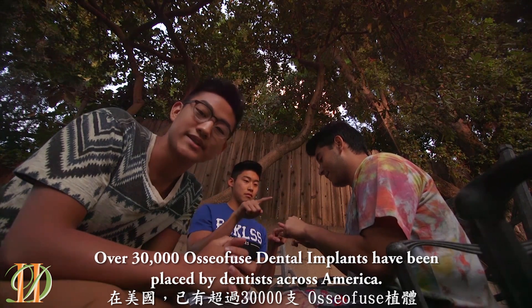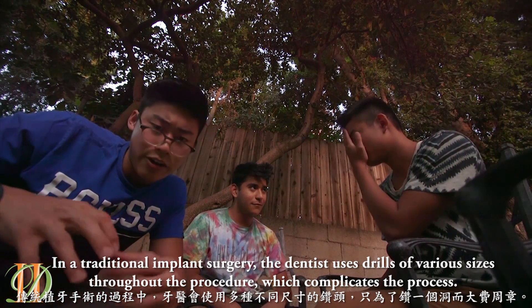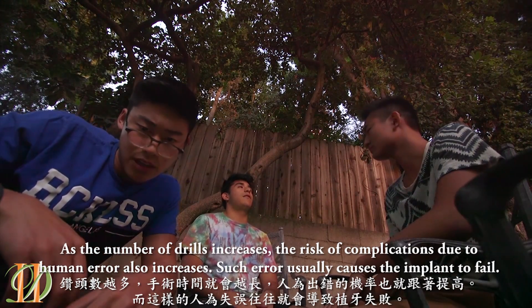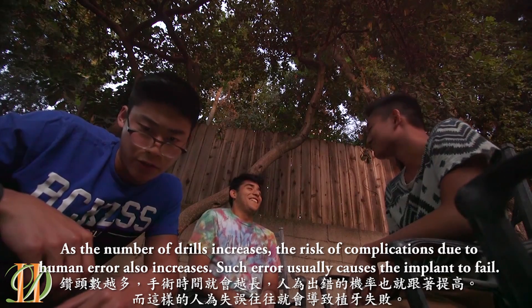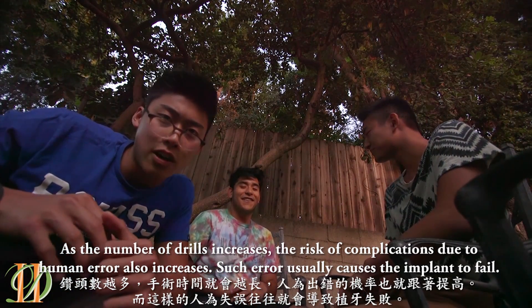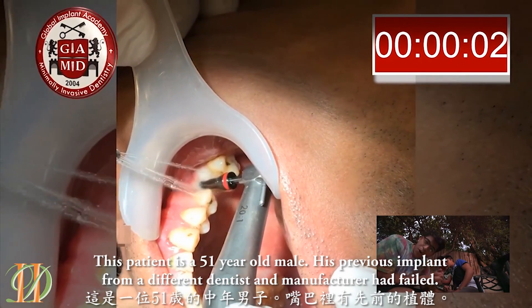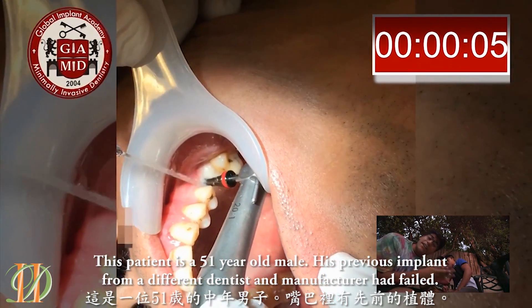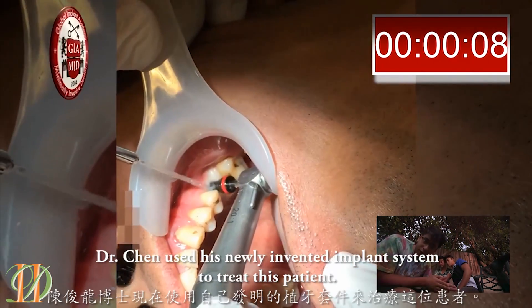In a traditional implant surgery, a dentist uses drills of various sizes throughout the procedure, which complicates the surgery. As the number of drills increases, the risk of complication due to human error also increases. Such errors usually cause implants to fail. This patient is a 51-year-old male whose previous implant was from a different dentist and manufacturer, which failed.